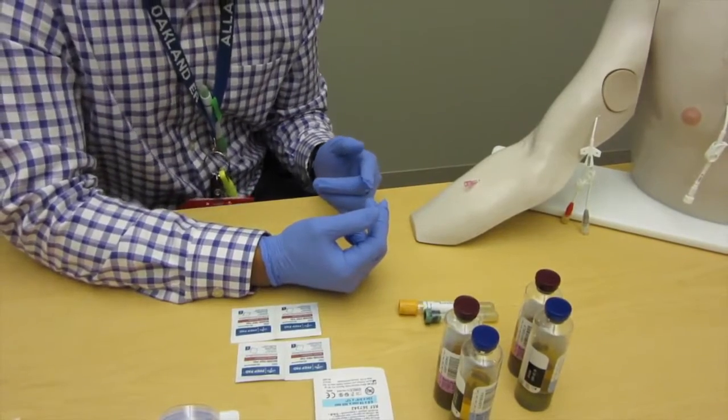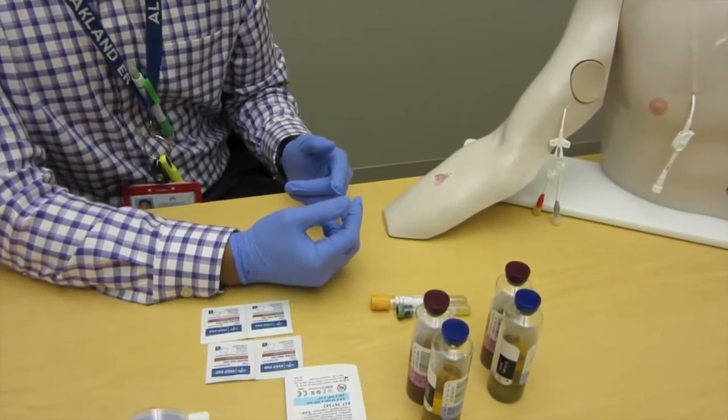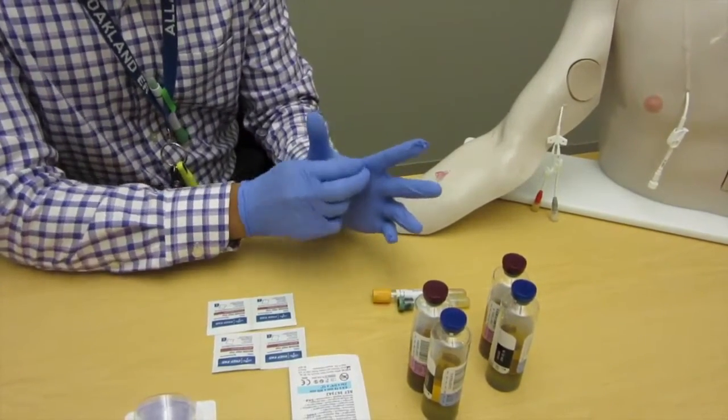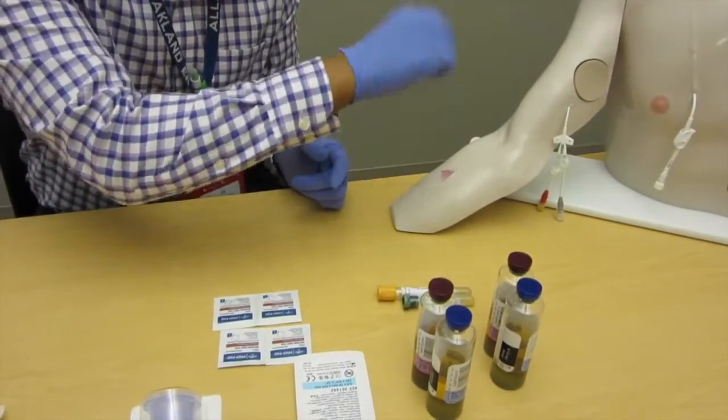Let it dry for 30 seconds, which I'm also going to do right now. 30 seconds is a long time, so altogether just the prep part of it is one minute long.